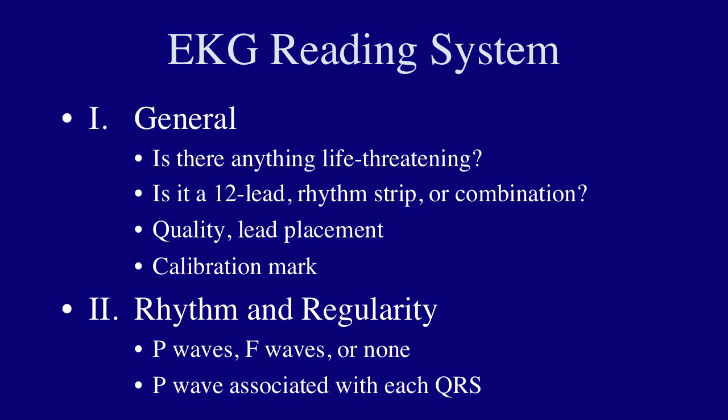You can look at any electrocardiogram that we've looked at throughout the course. In fact, I would recommend that you try a few of these and practice a reading system. This system is similar to the one on the back of the small text, but a little bit different, so just follow these slides. One EKG you could look at as an example is page 10 in the course pack, and I'll refer to that as we go through the system. But you can try any EKGs, and maybe multiple ones.